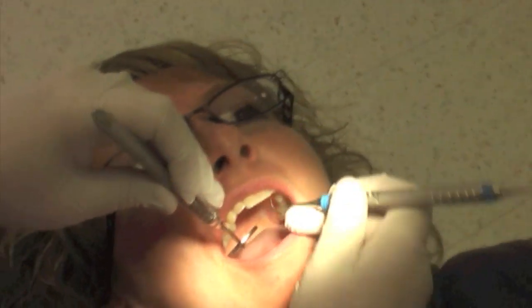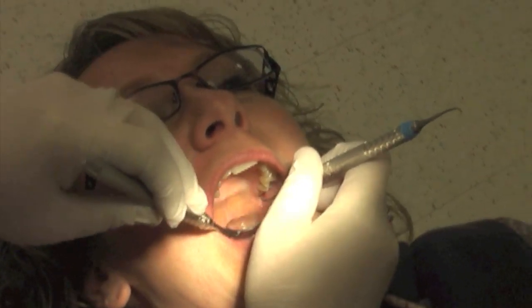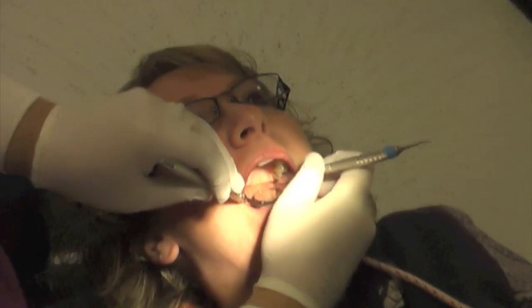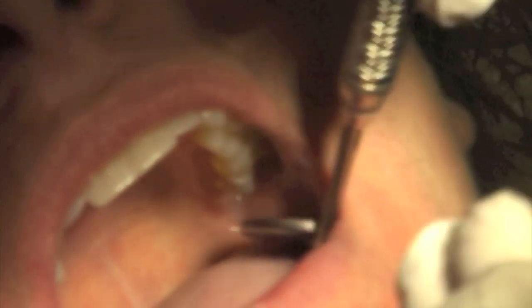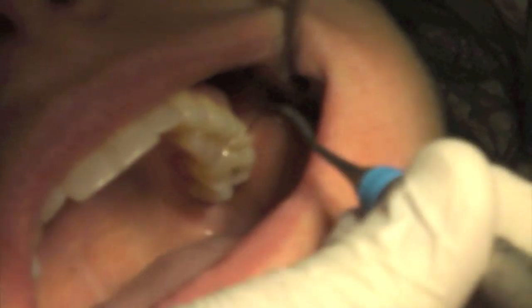From the 8 o'clock position, the linguals of the maxillary posteriors are going to be in the position for you to gain access to better. In the 8 o'clock position, you're also going to be able to get to the distal of those molars more easily.